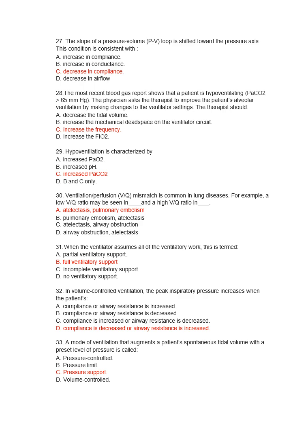31st question. When the ventilator assumes all of the ventilatory work, it is termed as. So that is, all the breaths are provided by the ventilator, then it is a full ventilatory support. Next question.